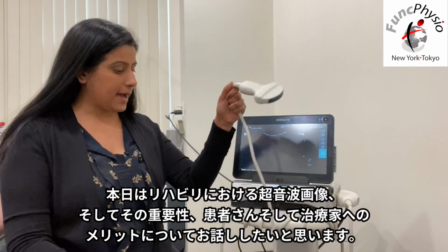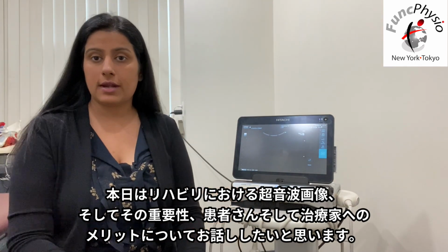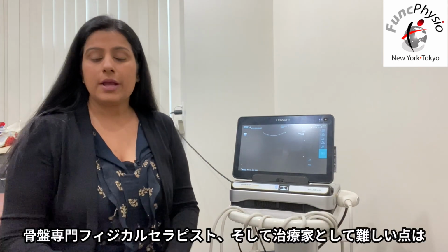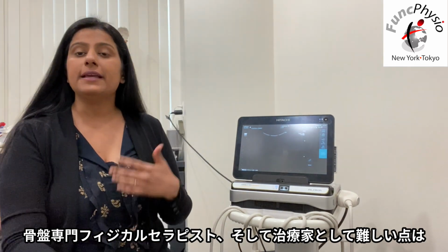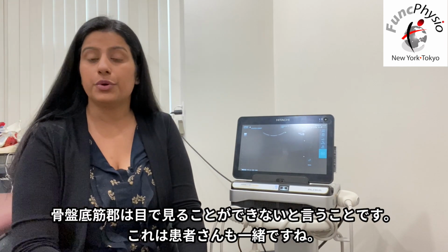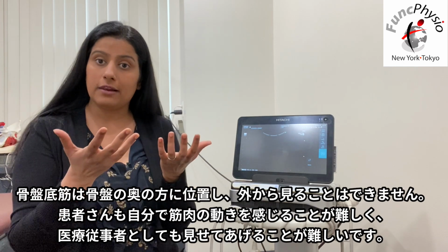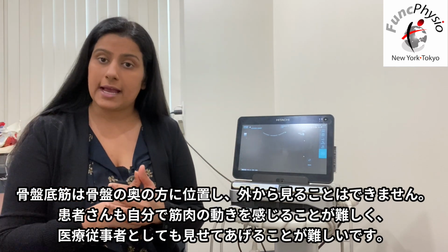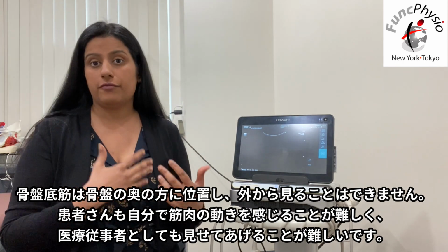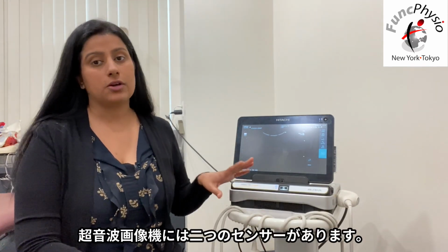Today I'm going to talk about ultrasound and rehabilitation and why it's important and very beneficial for patients as well as practitioners. So in pelvic floor physical therapy, one of the biggest challenges we face as practitioners, and even as patients, is that you cannot see pelvic floor muscles. They are present deep inside the pelvis. They are not visible from outside, and it's hard for patients to feel what they're doing. It's hard for practitioners to show patients what they're doing. And that's why ultrasound solves this problem.